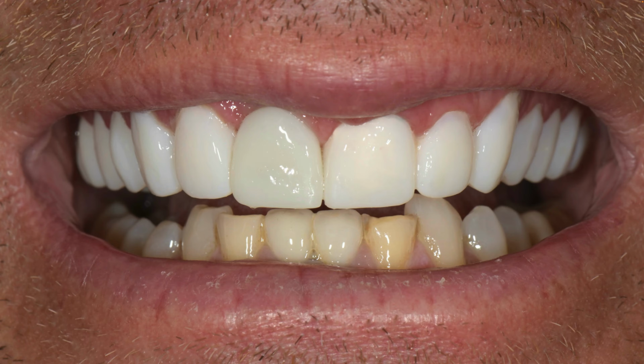And then here's the provisionals. So at the end of day one, we had the new provisionals. We have the modification to the implant provisional, and we have the patient trying to function that against the lower, and that's not the way it's supposed to be. So I just let the patient know, your bite's going to feel really funny. We'll try and maybe shave down some spots on the lower anterior if needed so that you have some even contacts, but you won't have a great occlusion. He basically had a posterior open bite until the next day. So it's only one night. I advise them to have soup and a light amount of food, and we'll be okay.